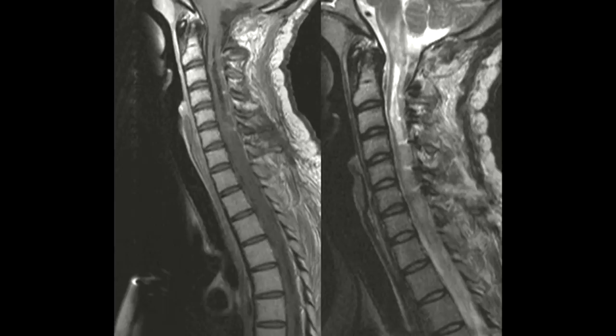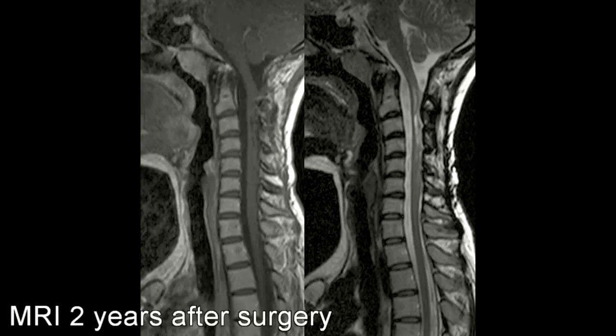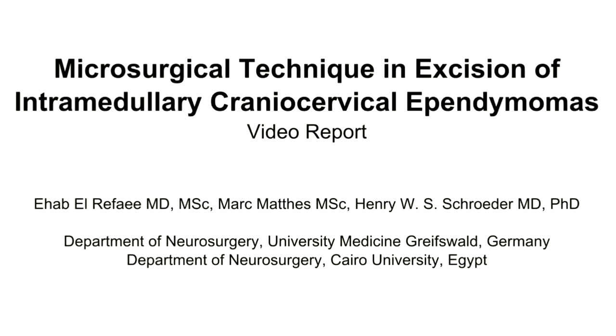So as a conclusion, the irrigation dissection technique is a very important step in excision of intramedullary tumors, where the plane of the tumor can be identified and easily resected from the viable cord tissue.